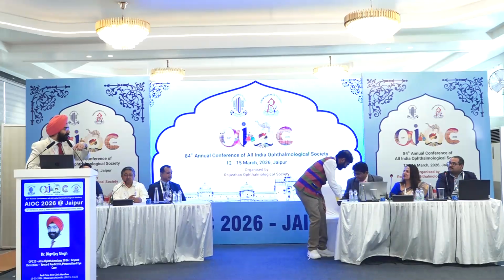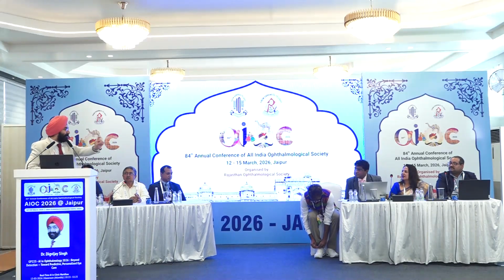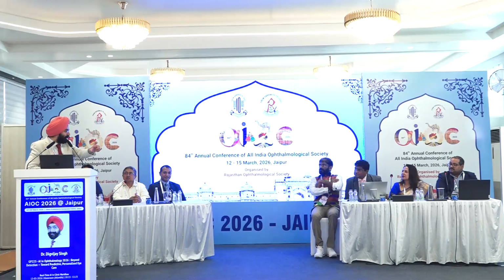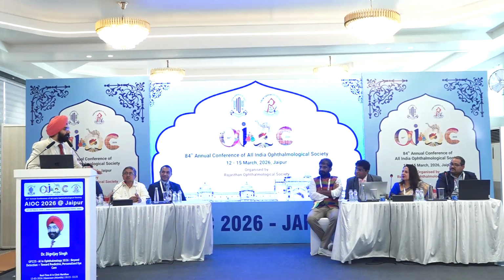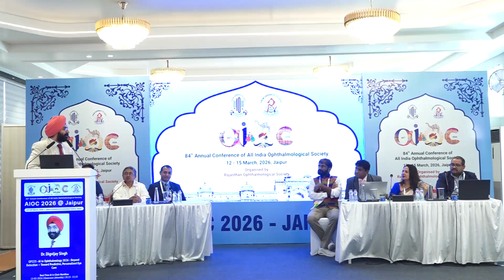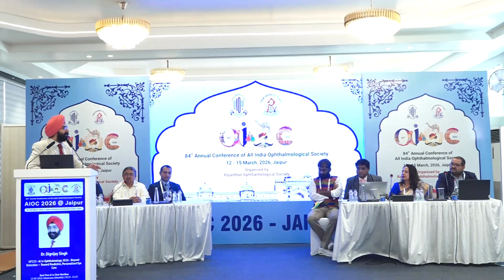In case 2 that I showed, the patient actually came to me with that report saying, doctor, this is what it is saying, what should I do? I opened it, kept a screenshot and showed him. I said, see, it is also mentioning here that this was test-retest variability. If you've gone today and to another center tomorrow and done the same test, don't think you've progressed in one day. So sometimes AI can misguide in that sense. It scares, just like Google scares a lot. So you have to rationalize it for them.